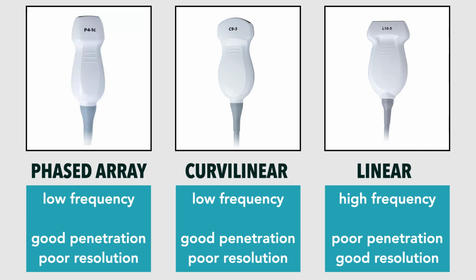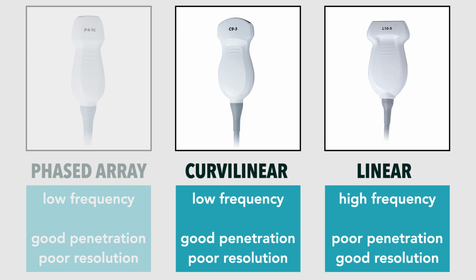Now, as you've discussed earlier today, we have a few options for ultrasound probes. Which would be your choice to evaluate McKenna? In pediatrics, a linear probe is going to be your probe of choice most of the time. Scanning for appendicitis with this probe offers good resolution. Sometimes, particularly in larger patients, a linear probe may not offer enough penetration, and in those cases, you can try using a curvilinear probe.